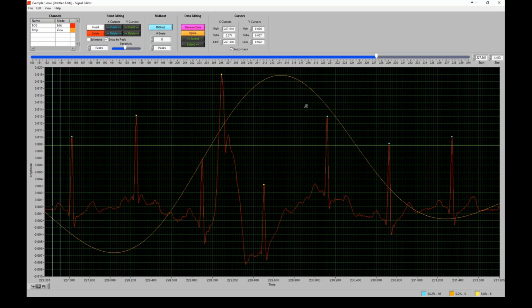And we can see everything with much more clarity now. So what we can see in the beginning of the window here is a completely valid, actually beautiful ECG cycle. We can see the P wave, QRS complex, and the T wave afterwards. And we can even sort of see that here, but we can see it starts to get a little noisy. And then we can see that right here, but we can see that it hasn't been identified.